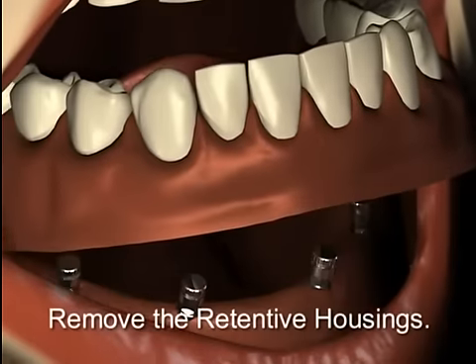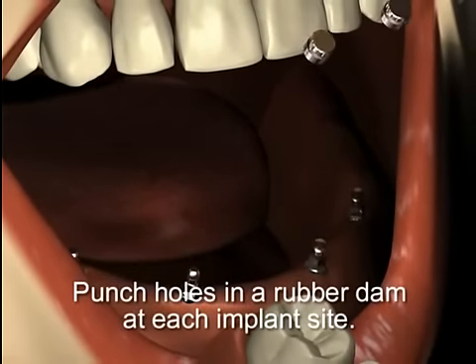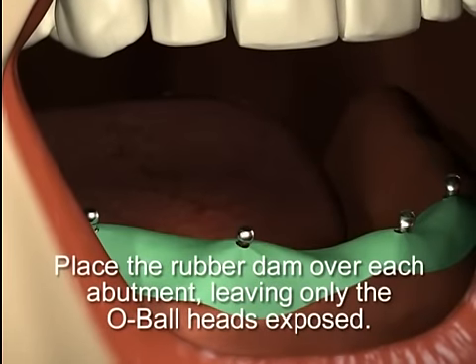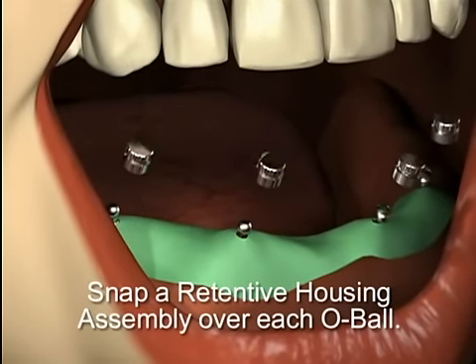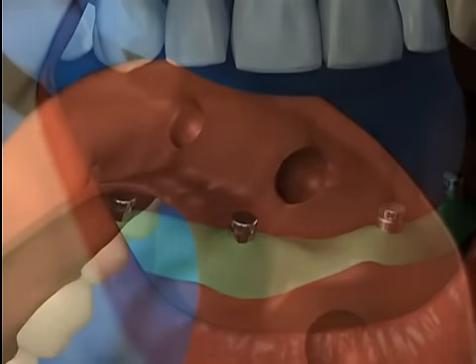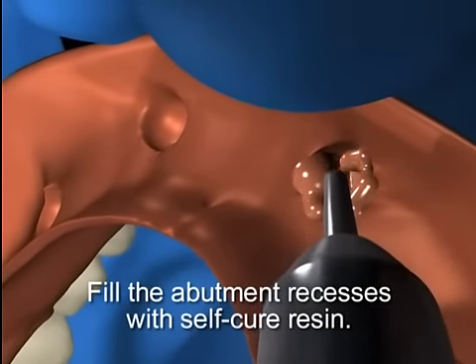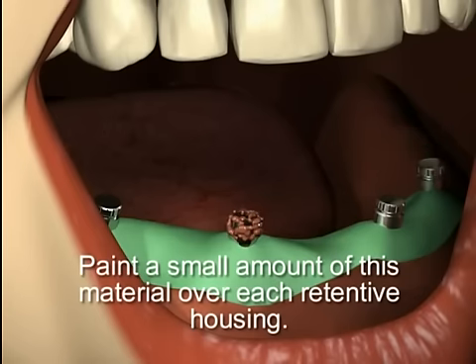Remove the retentive housings. To prevent any acrylic lock-on, punch holes in a rubber dam at each implant site and place the dam over each abutment, leaving only the O-ball heads exposed. Snap a retentive housing assembly over each O-ball in preparation for the final seating. Clean, wash, and dry the denture. Fill the abutment recesses with self-cure resin. Paint a small amount of this material over each retentive housing.